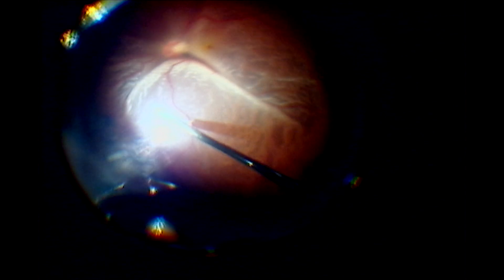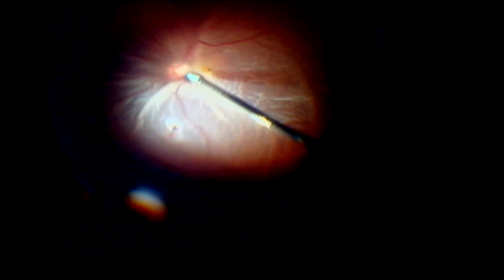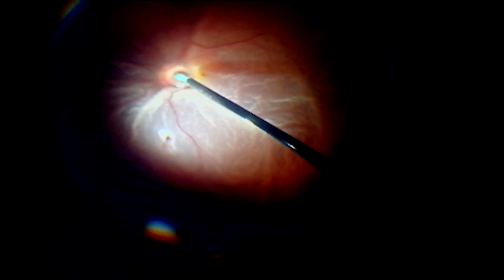As you can see, the media clears, and I can proceed with reattachment of the retina in this case.